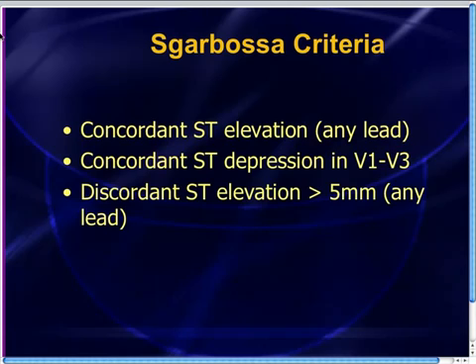These are probably more validated for left bundle branch block pattern, but there's a handful of studies that have shown that this is also true, and perhaps even a little bit better for reading ischemia or infarction in the presence of a pacemaker. Essentially, when you lose that appropriate discordance, you are with very high specificity looking at a patient who's got a myocardial infarction.